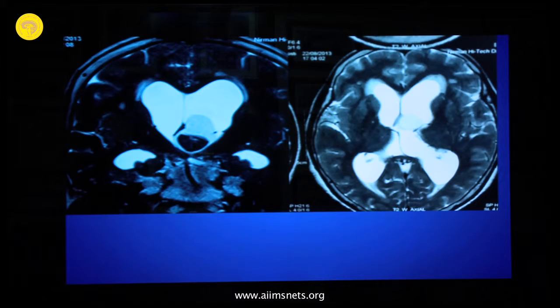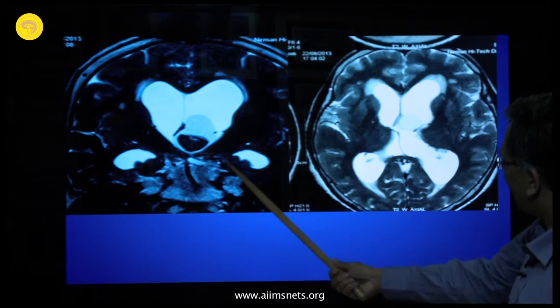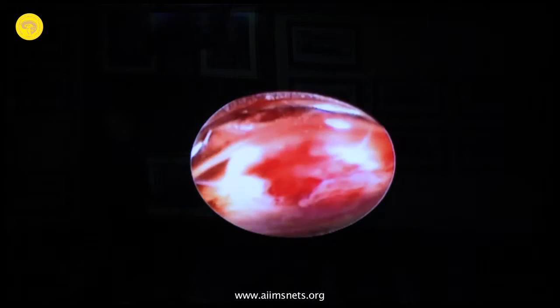And now comes the colloid cyst. Such a simple tumor, wow. It's pointing towards one ventricle, you can go right in, just remove it, and such a beautiful job, right? Let's see what happens. So again the same thing, I'll take you through it, because that gives you an orientation. And then you actually go inside.